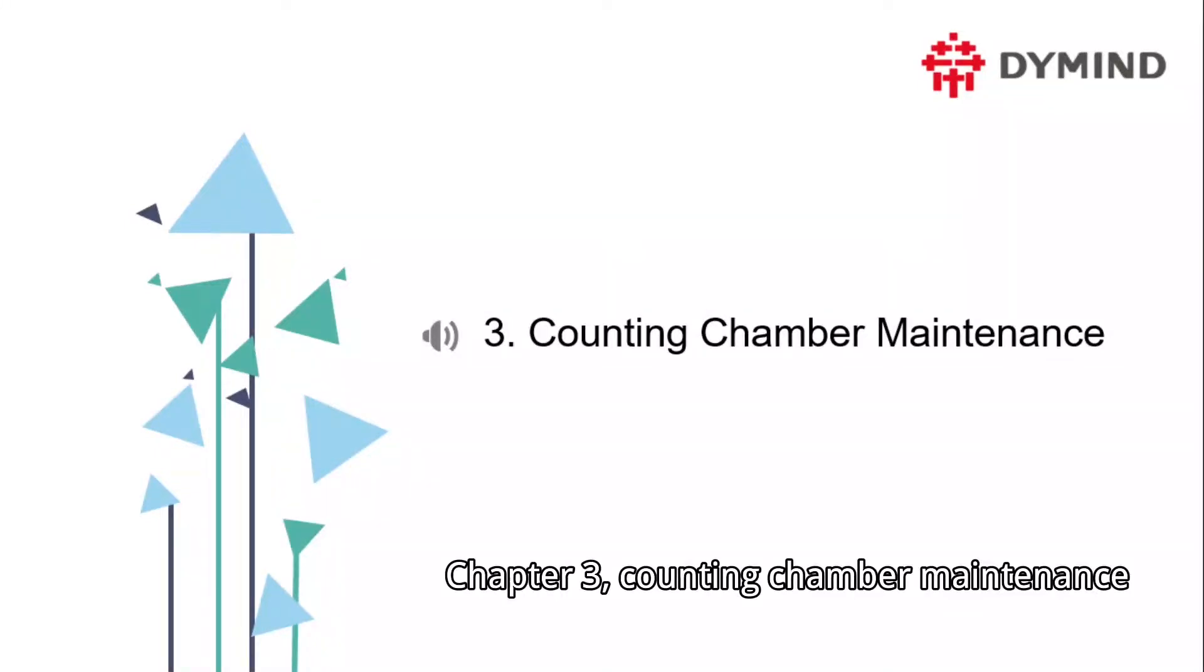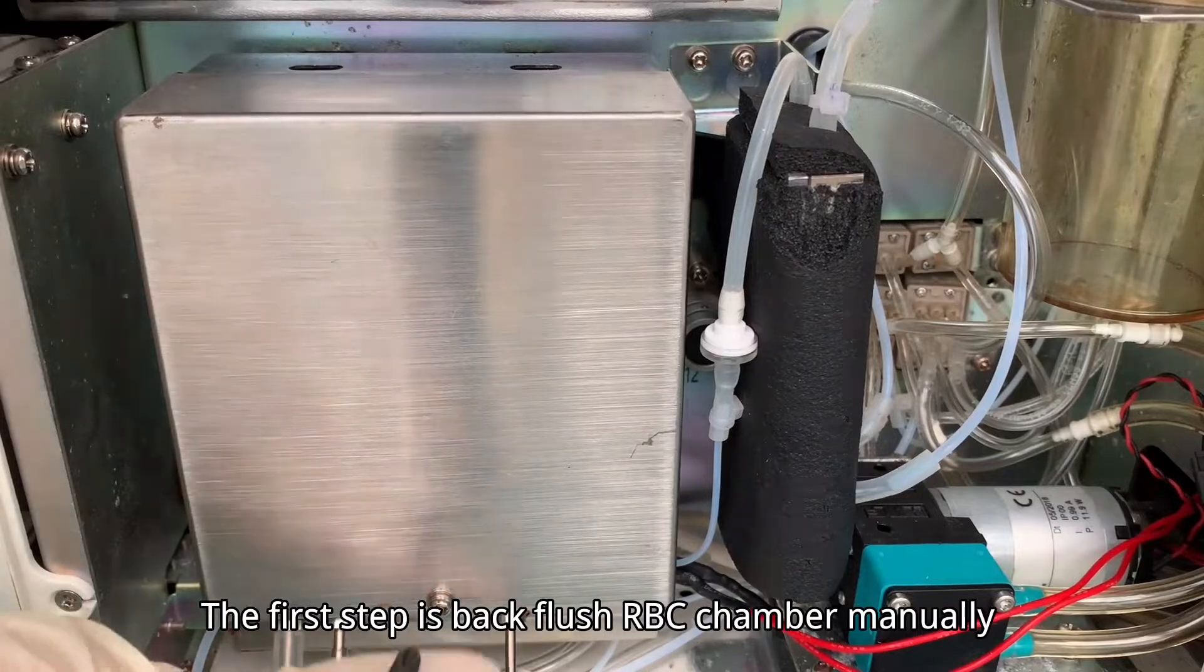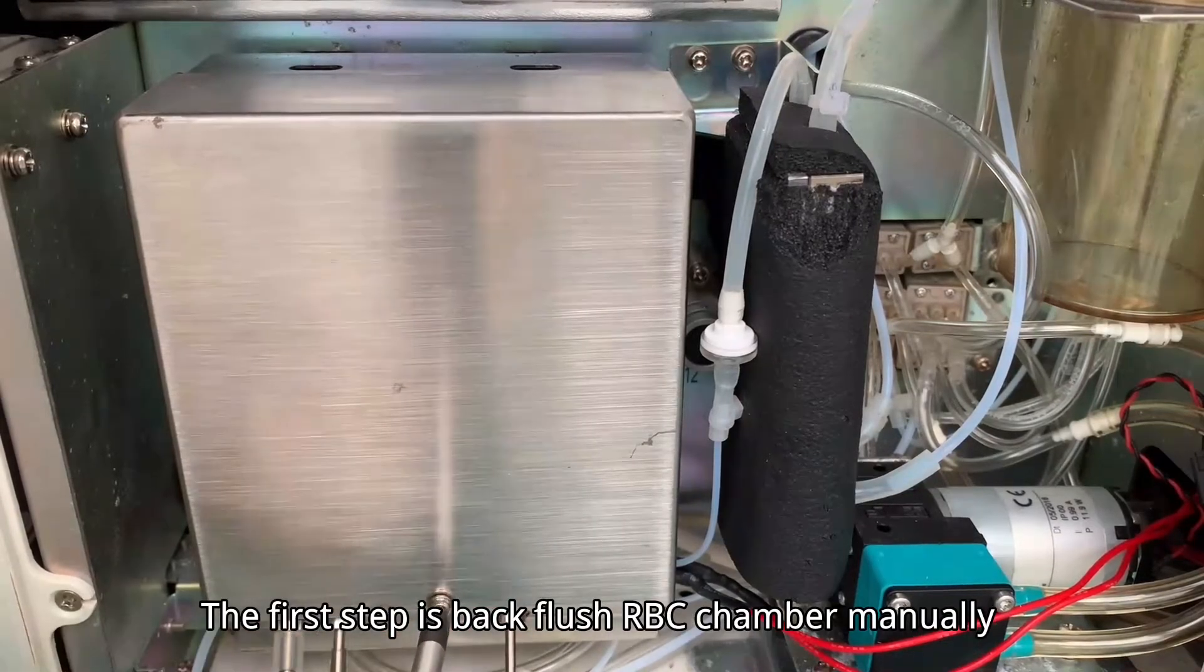Chapter 3: Counting Chamber Maintenance. The first step is to backflush the RBC chamber manually.